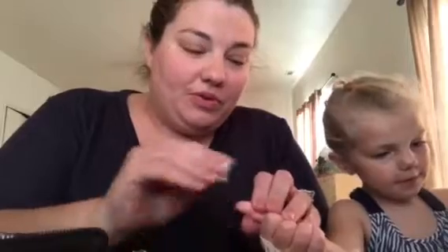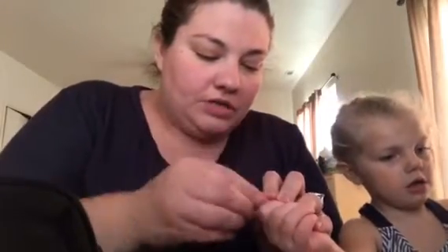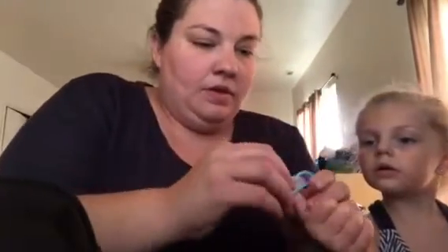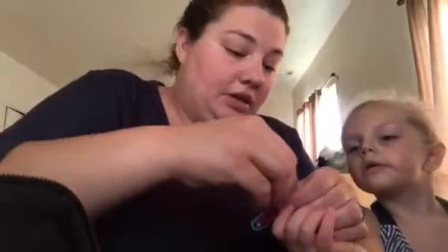She is three years old, for those of you who don't know. She turned three in June, and she is a trooper. So I just clean her finger, then we poke her, get some blood in the tester, and then we get to put a band-aid on. While it reads, I put her band-aid on.